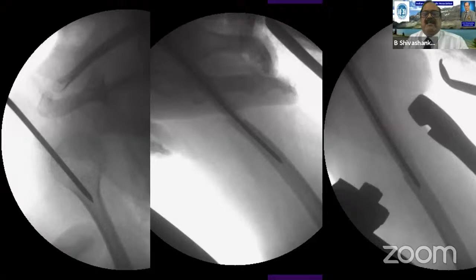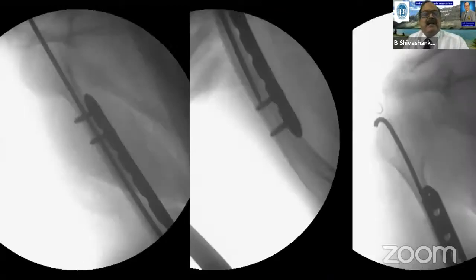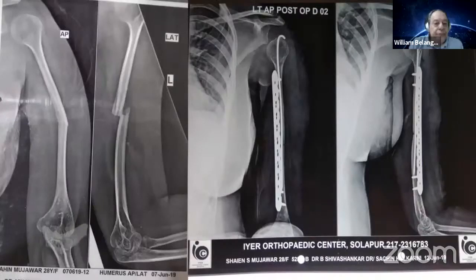Okay, what I did was, since the shoulder was pliable, I thought of inserting a Rush nail from the top and stabilizing, and I was able to pass only a 3 millimeter Rush nail, and I added that with a radius ulna locking plate with a simple screw. I have not used a locking screw. I use a locking plate normally, but try to use a cortical screw in them. This is how I treated.